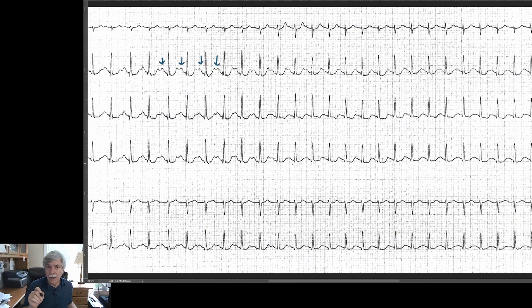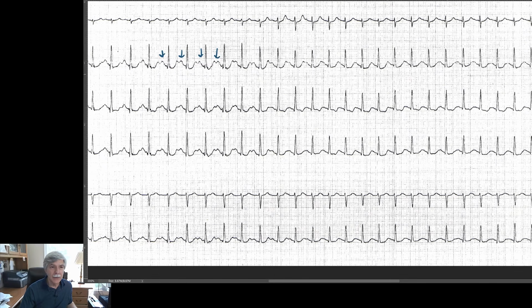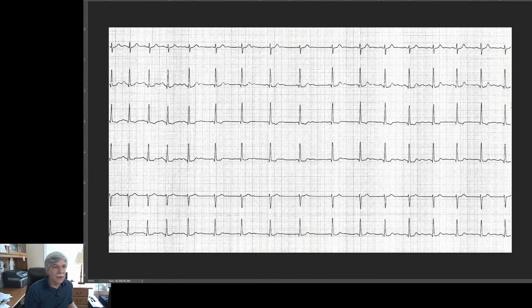It's an atrial tachycardia. And it's because it's coming from the top of the atrium and it's heading towards the feet because it's upright in the inferior leads. And the other thing is it's beginning to slow down. And then it gradually slowed down and slowed down more and more until finally this last strip over here, if I can pull it up. Okay. Here. It slowed down to the point where it's about 120 beats per minute right here in the beginning of this strip, and then suddenly it went away. And the patient was back in a sinus rhythm at about 60 or 70 beats a minute.